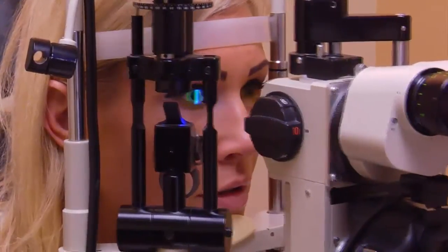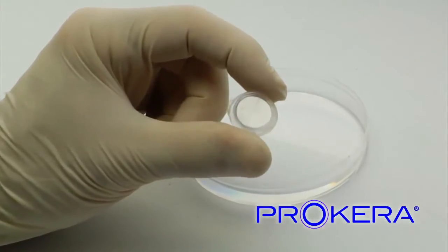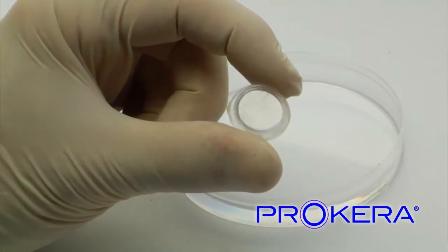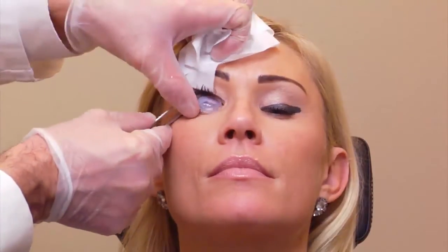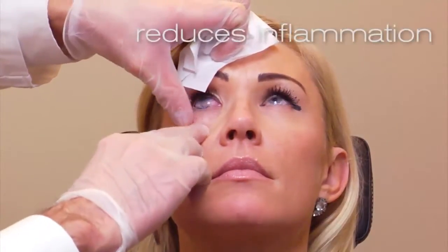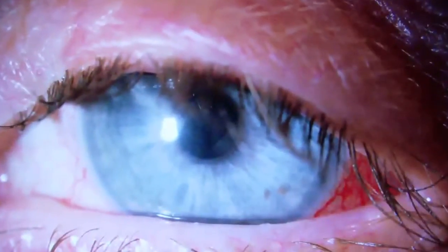Thank you for coming to our practice for your eye care. For certain eye conditions, this practice recommends Prokera, a dual action therapeutic device that is used to heal damaged or inflamed eye surfaces. Dual action Prokera reduces inflammation and promotes healing on the eye surface. Inflammation, redness, and pain must be controlled and reduced in order to allow for optimal healing.